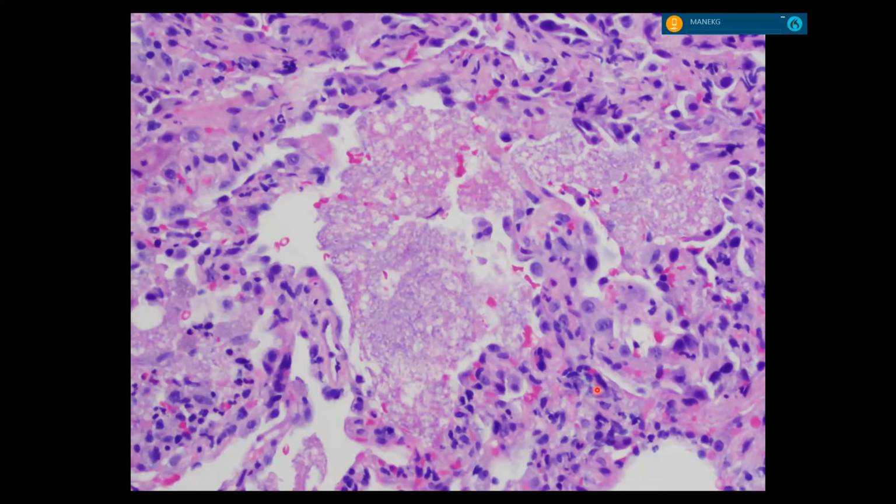No, but that's not what the organism is. The organism is here. See all this stuff in the alveolar lumen? It's kind of a frothy looking thing, right? That froth is full of organisms, and it typically contains these small dots. Just see right above, see that little dot? Then see that little dot there? Now I'll remove the thing and see how many little dots are in that thing. It's like a frothy thing with little dots. Each little dot is one organism. That's what Pneumocystis looks like.